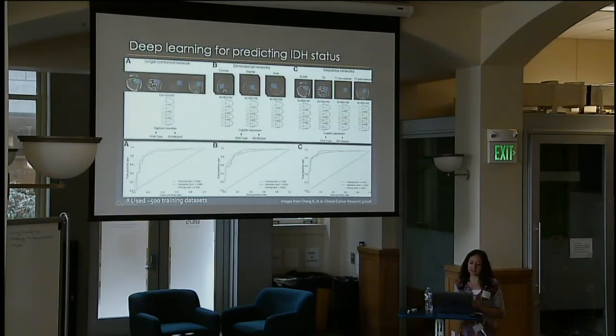And using the combined anatomical imaging, 2 types of T2 and pre and post contrast T1 weighted images, they were able to get a better prediction accuracy. Still, other molecular markers have not been investigated yet. This is only the first one of this type to come out, and it only was 2 months ago.